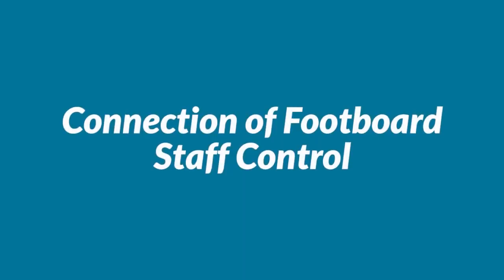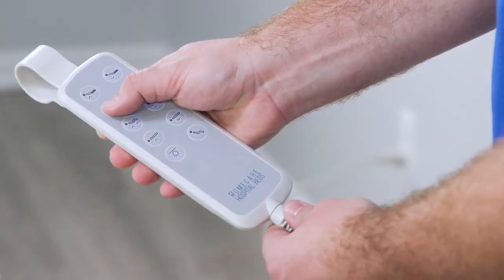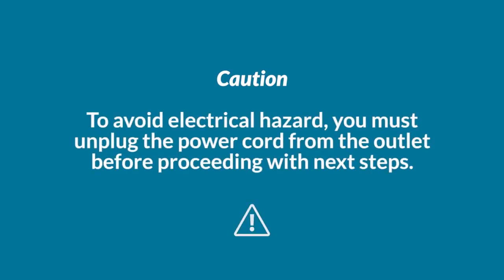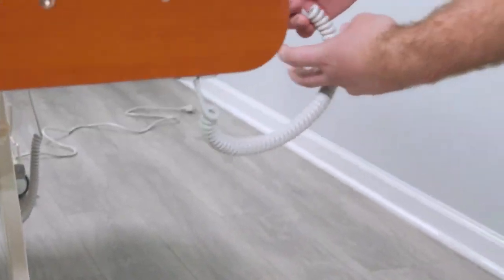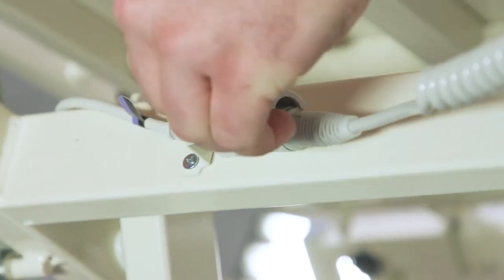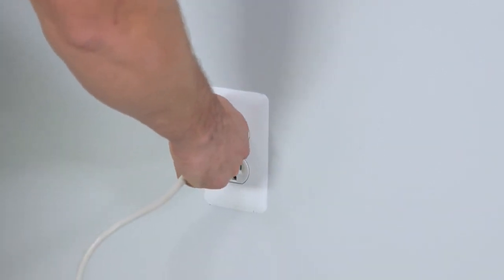Connection of footboard staff control. The staff control needs to be connected to the control box. Raise the foot deck to the highest position, then unplug the power cord. CAUTION: To avoid electrical hazard, you must unplug the power cord from the outlet before proceeding with next steps. Find the extension port on the side of the bed frame and hinge open the extension port cap. Plug the footboard staff control cord into the extension port and secure by pressing the extension port cap closed. Plug the power cord back into the wall outlet.